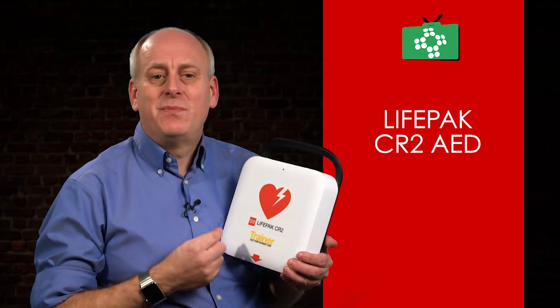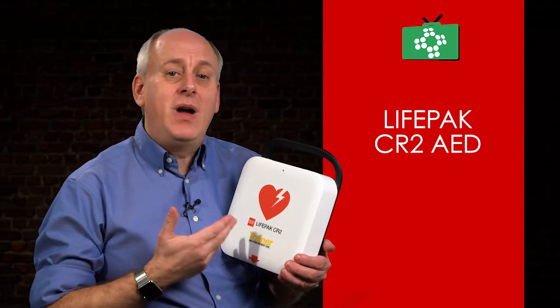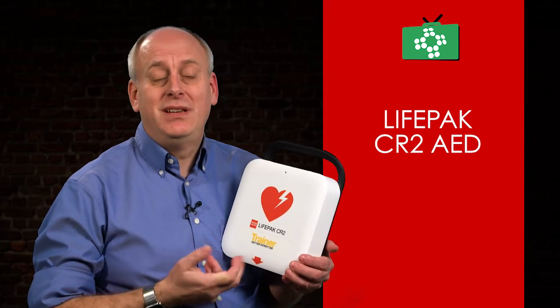It also detects background noise and adjusts the volume accordingly for clear instructions. Being bilingual, you can simply toggle between two preset languages when using the device.